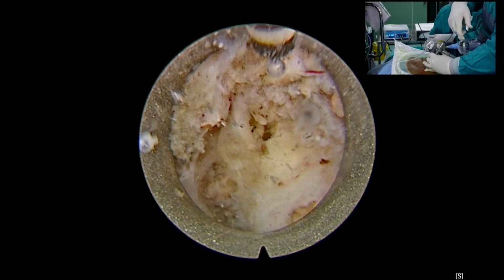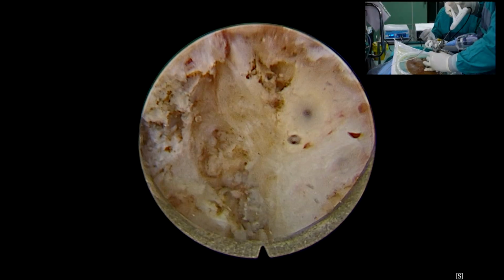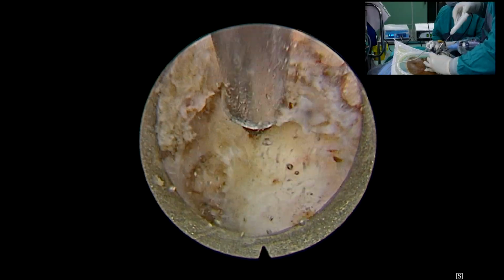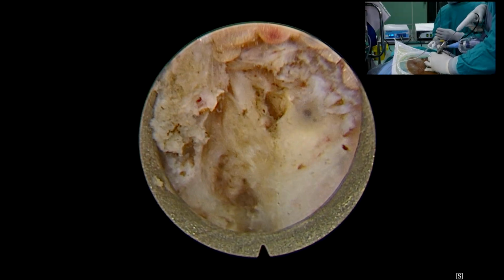So the yellow thing visible is the ligamentum flavum, and the interlaminar window is more clearly visible now. Only this much. The yellow structure that's visible is the ligamentum flavum.